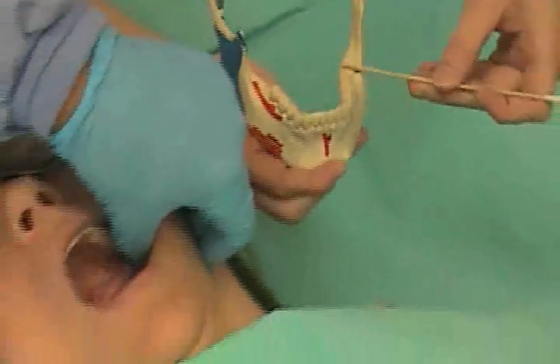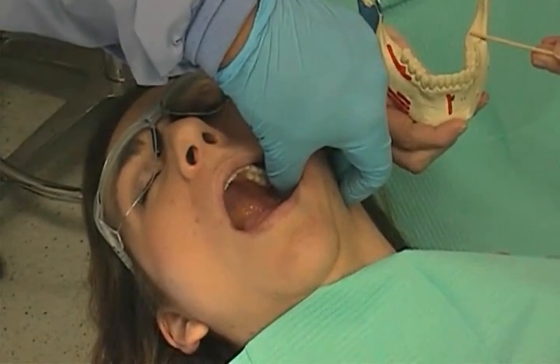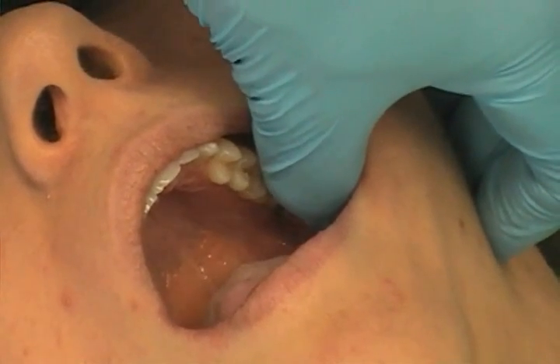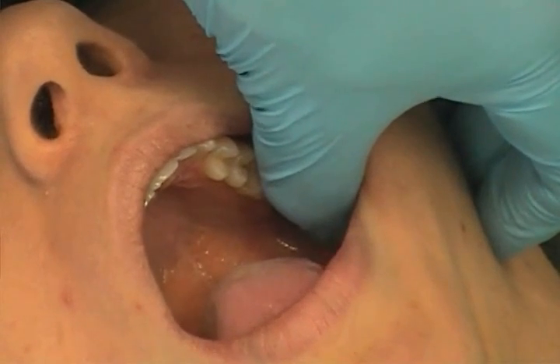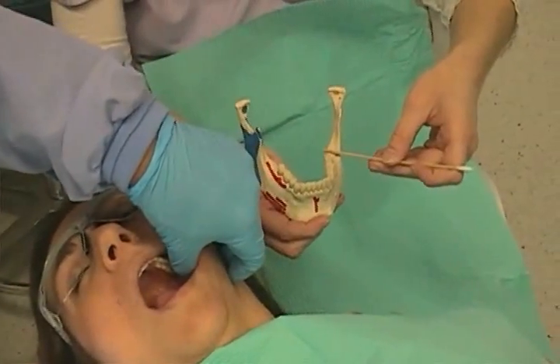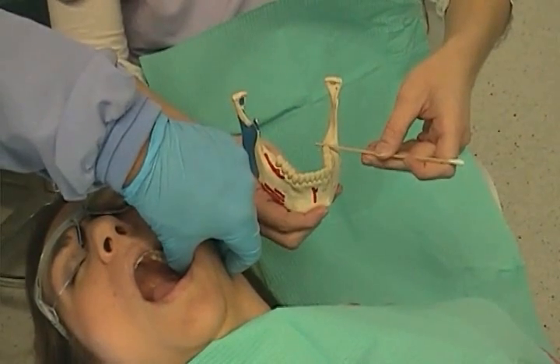From there, you move the finger back about three millimeters, because immediately under the thumb, as you've moved the thumb back three millimeters, you will encounter bone and tissue. Between the raphe and your thumb tip is a soft spot, which in normal anatomy is very pronounced. But in cases like this, it represents a very small window of soft tissue, and that is your target area.